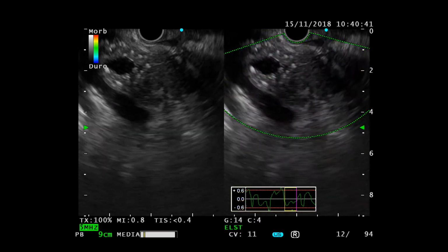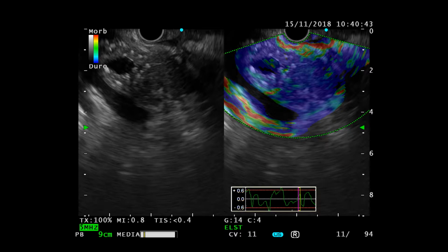And a very provocative question for Claudio. Claudio, can you hear us? Claudio De Angelis? Where are we with artificial intelligence and the ultrasound identification of focal lesions? That's the next challenge, no? Yes, we definitely need some artificial intelligence because this is for sure the hardest situation.